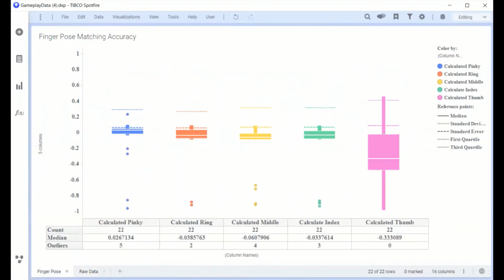The goal of the game, and for the user to see just how well they did, is to be as close to the value 0. Being closer to 1 shows the user they flexed too much, and being closer to -1 shows the user they didn't flex enough. As you can see, the user did pretty well with their pinky, ring, middle, and index finger, since the first and third quartile markings show very small margins. As for the thumb, the values have a pretty wide range, and this tells us that the thumb had little mobility or there was an issue with the sensor itself.